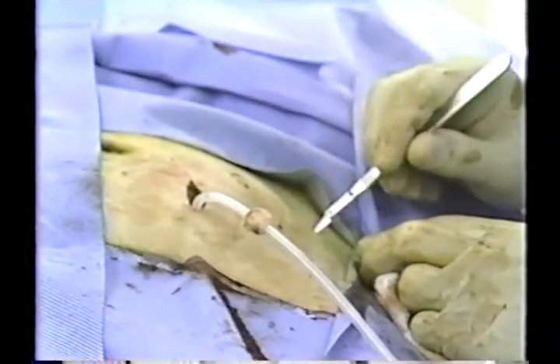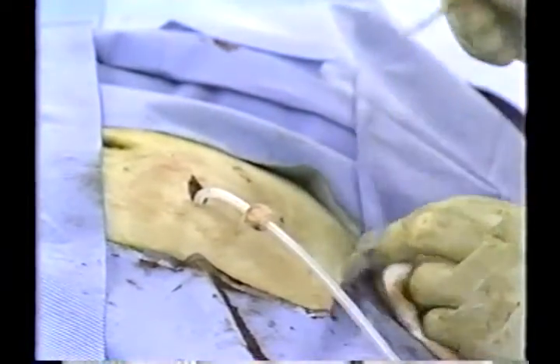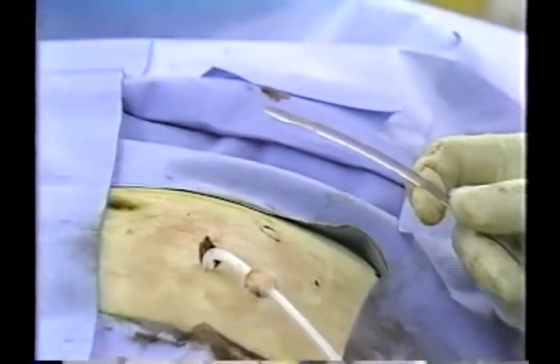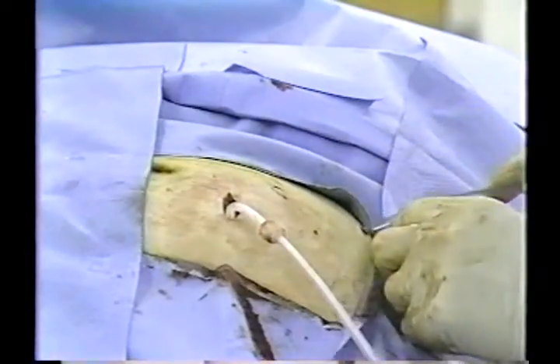A stab incision at the exit site is made to the full width of the number 11 scalpel blade. This allows a tight seal around the catheter at the exit site.